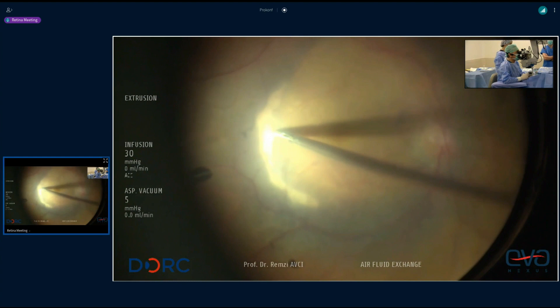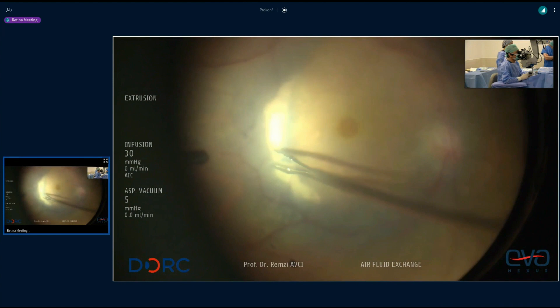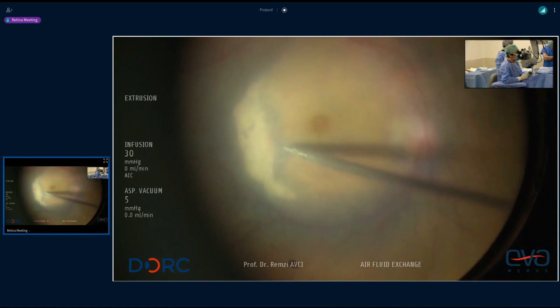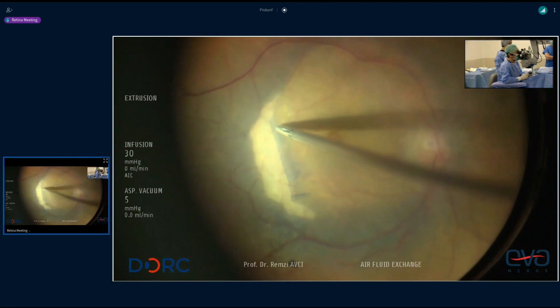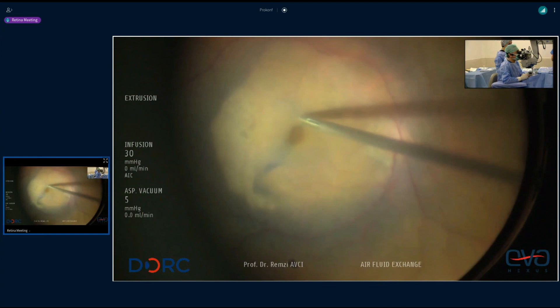One advantage of ICG is that it really stiffens the ILM — it really changes the characteristics of the ILM. I will confess publicly that I still use ICG for temporal flaps, because I find it's simple. Do you agree with that, Grazia? Yeah, I don't use it, but it's so easy, because indeed it changes the characteristics of the membrane. It lifts up very easily and you don't have to pull and push too much.